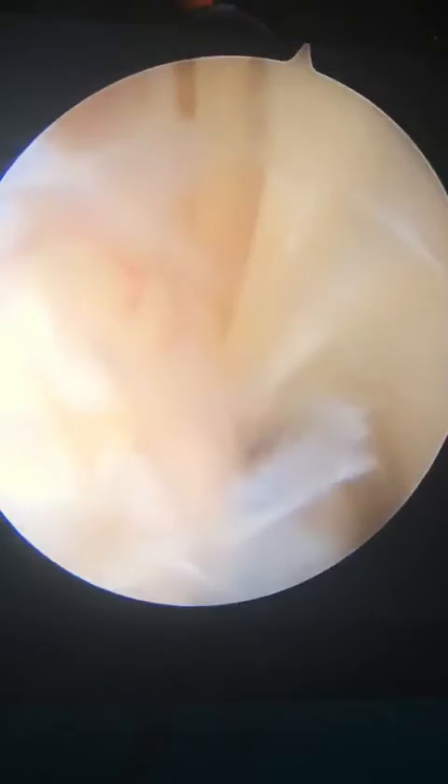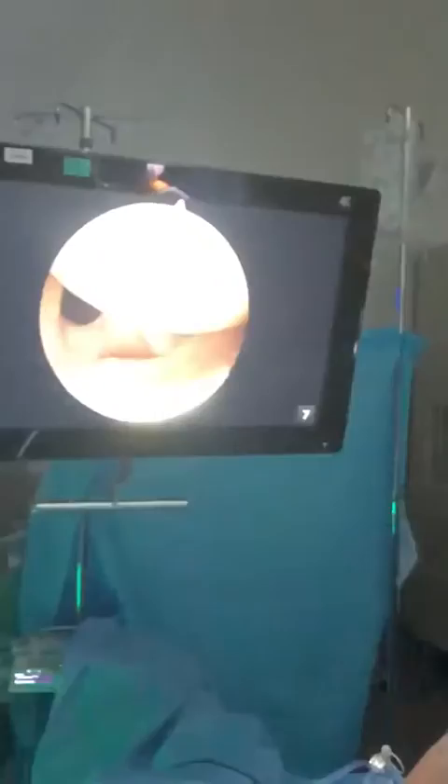We're going to look here at the back of the rotator cuff on the joint side. So these are the fibers of the rotator cuff inserting into the shoulder.